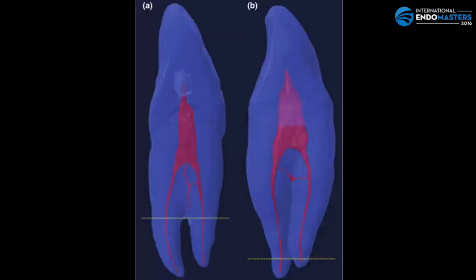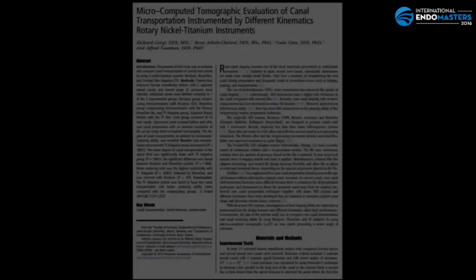In this 3D image, we can imagine what the canal system looks like with the two different roots and an accessory canal in the middle of the tooth. Another view of the same tooth, so you can imagine how hard it was to treat this case.